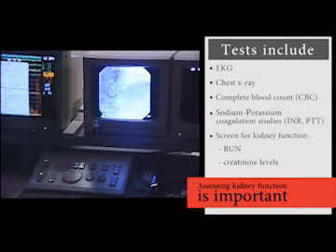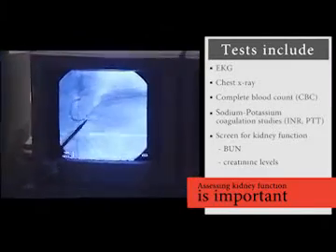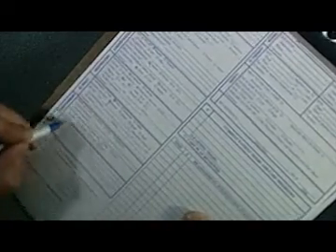Assessing kidney function is important because the contrast medium used during the procedure places an additional burden on the kidneys, and in fact may cause kidney damage. The patient's admission history and physical assessment should be completed, and a history of any current medications and allergies obtained.